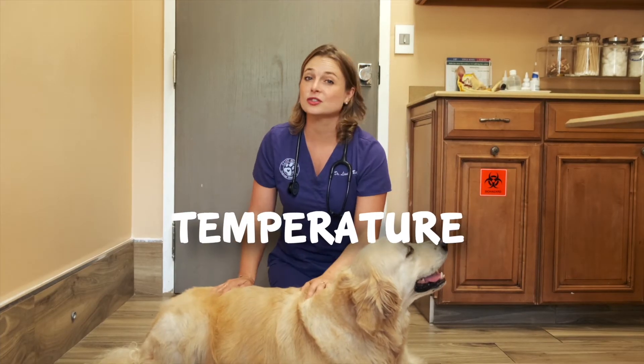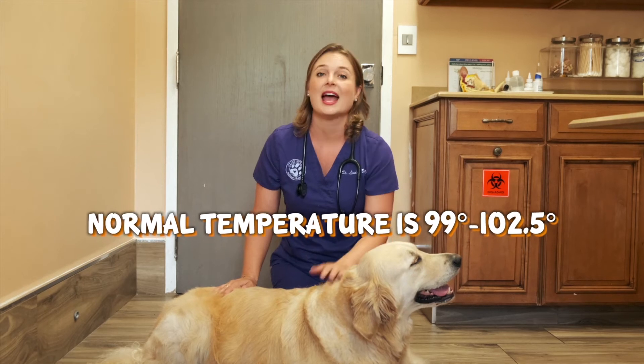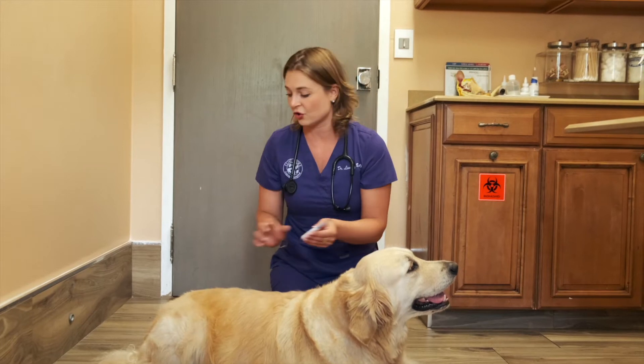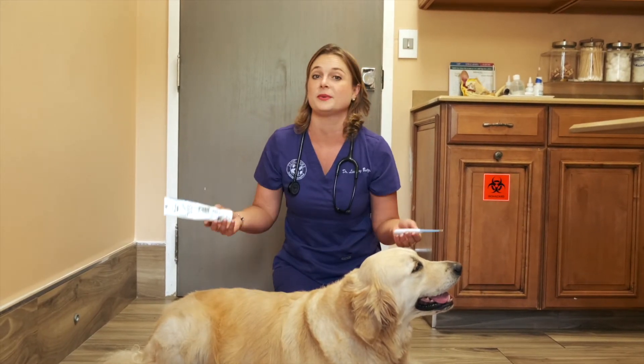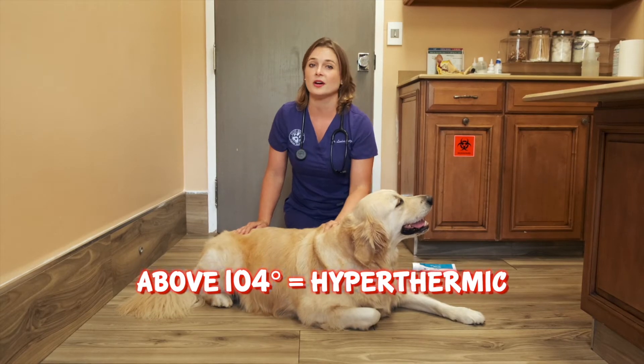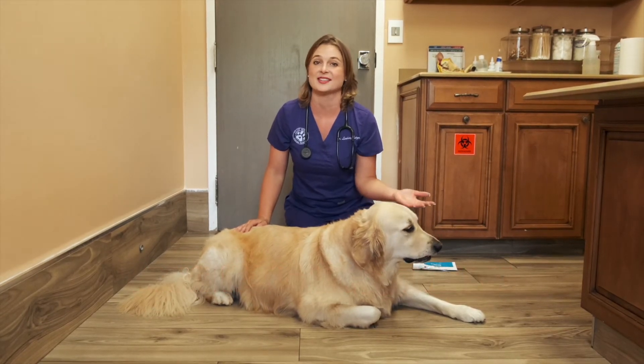Temperature. A dog's normal temperature is 99 to 102.5, and the best way to take their temperature is using a digital rectal thermometer with lubrication to obtain this value. Below 96 is considered hypothermic, and above 104 is considered hyperthermic, which would warrant veterinary attention.